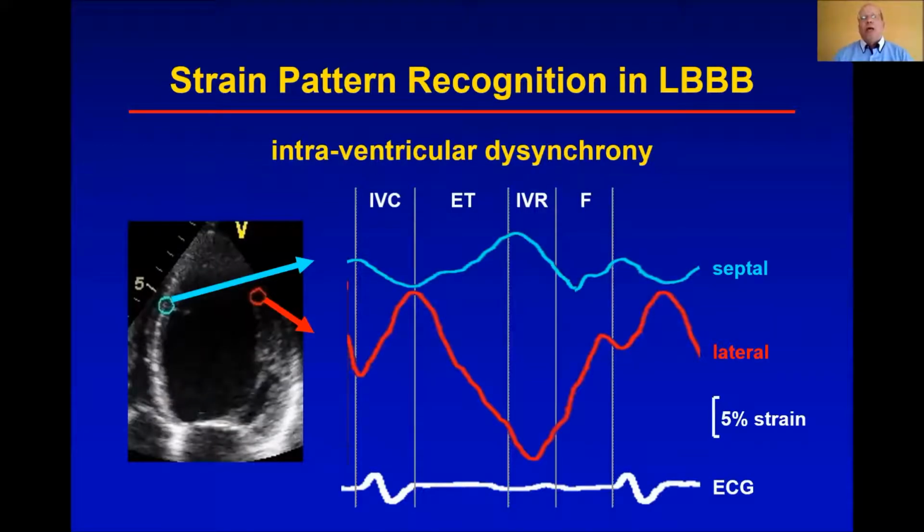So I was talking about visual assessment of mechanical dysynchrony, but we are talking here about strain. So what is strain good for? Yes, you can show exactly these changes in mechanical and regional mechanical function in the strain curves. If you're not trusting your eyes, or if you're not sure what you should say about that, maybe if it moves too fast or whatever reason, just do a strain analysis and you are very clear. What we see here in these patients is in the septum, the early contraction, a shortening of the myocardium. A shortening means that the curve goes downward. And this is what we see. With the onset of QRS, we have a downward slope of the septal curve.